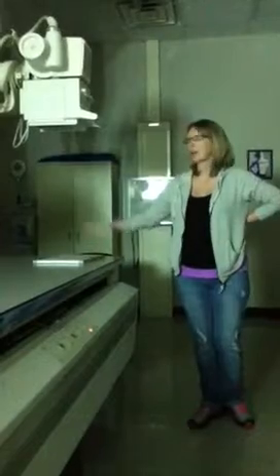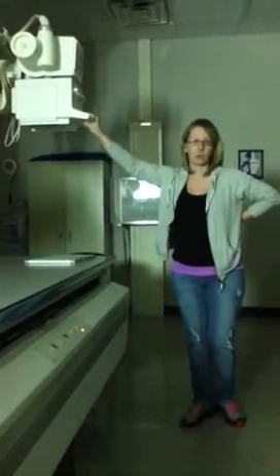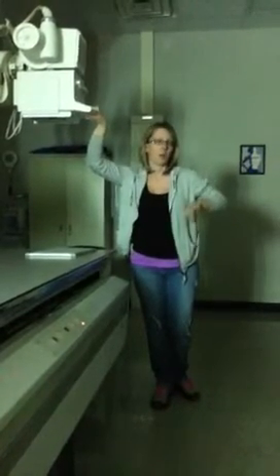You'll need to pull a chair to the end of the table, get an 8x10 cassette, and move your tube to where it is down at the end of the table where the chair is. You can go ahead and lock in your SID to 40 inches before your patient gets here, but you should probably wait to have their hand to collimate and to better accommodate them.